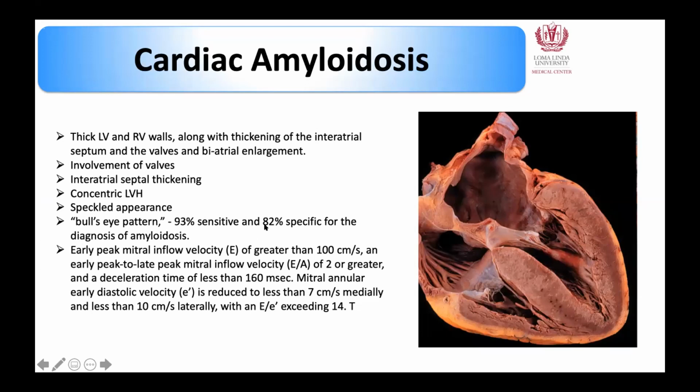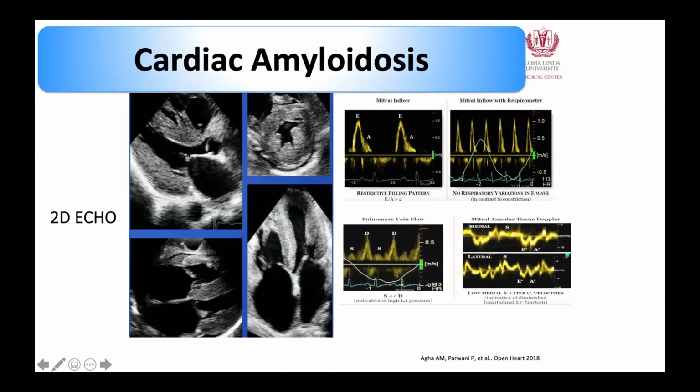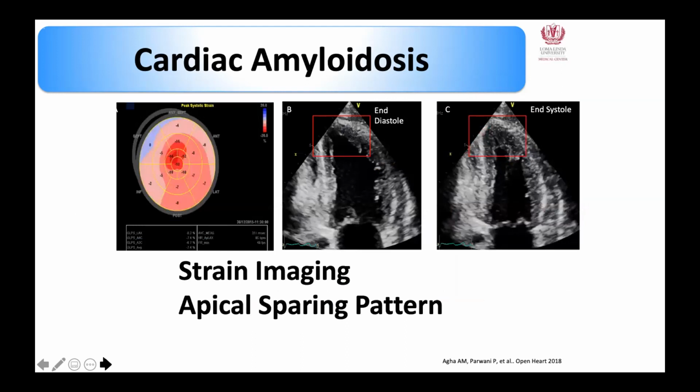And then the restrictive pattern. Remember the numbers on the restrictive pattern, because sometimes you may be given the E, the E by A, and the E prime numbers without being shown the image, so you may not automatically register it. So remember these numbers that are used for diagnosis of restrictive cardiomyopathy, because it can be just that in your question stem. Looking at the echo, the speckled pattern, as I told you, there is LVH, RVH. Look at the mitral inflow, look at the pulmonary vein Doppler, diastolic predominant, and then the tissue Doppler, which is quite low in numbers, very classic restrictive. So remember the numbers and imprint these images, because this is classic amyloid.